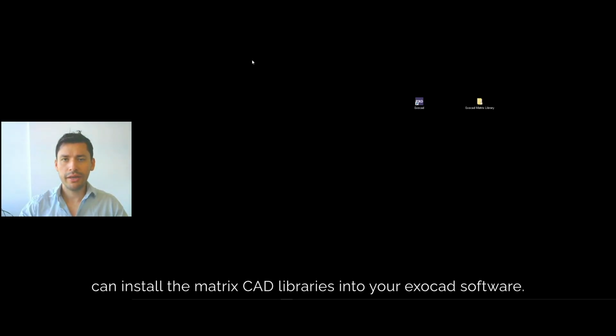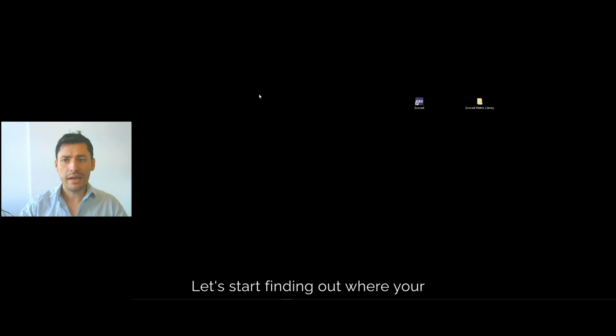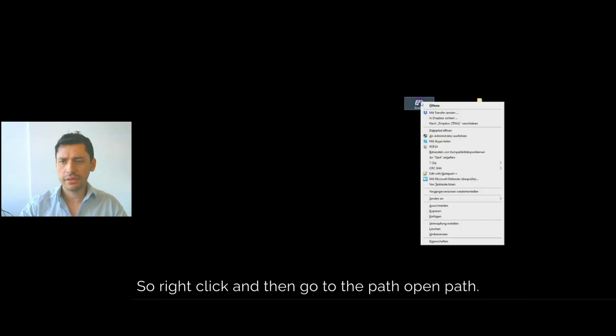Hello, in this video I'm going to show you how you can install the matrix CAD libraries into your exocad software. Let's start finding out where your files for exocad are saved. So right click and then go to the path, open path.